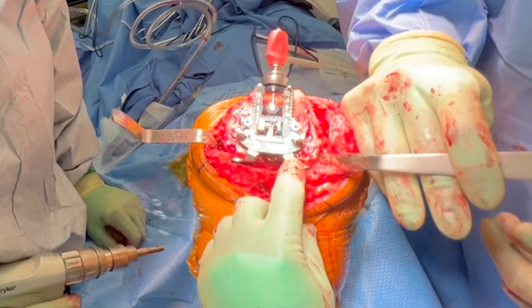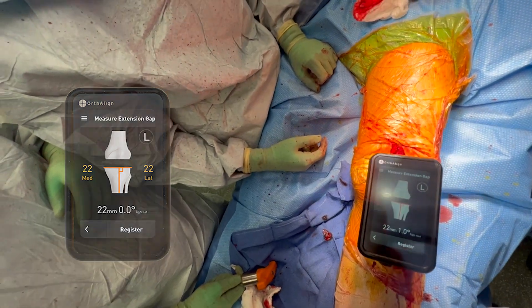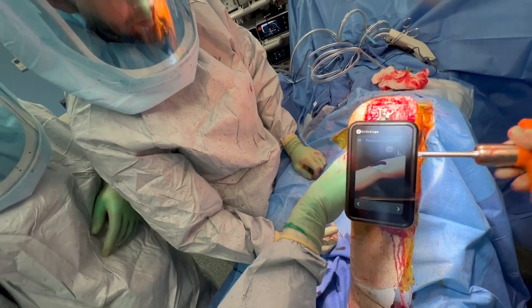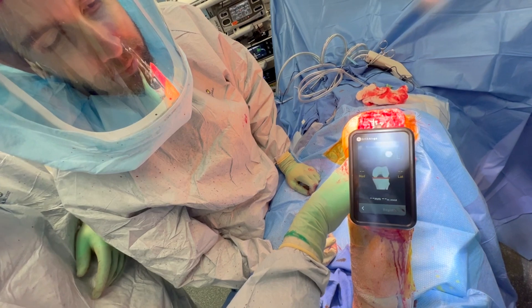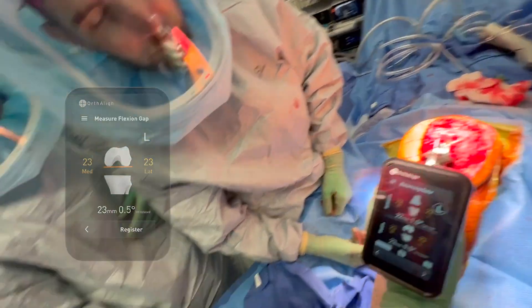Once all those cut pieces of bone are removed, I remove the medial and lateral menisci. Once I've done all that soft tissue work, I reassess my gaps. In extension, we're at 22 millimeters and symmetric — both medial and lateral, 22 millimeters. Rechecking in flexion, we're at 23 millimeters medial and 23 millimeters lateral. That's a really nicely balanced knee. One or two millimeter differences I usually don't worry too much about, but I always move on to the trial phase to see if I can feel any real differences.